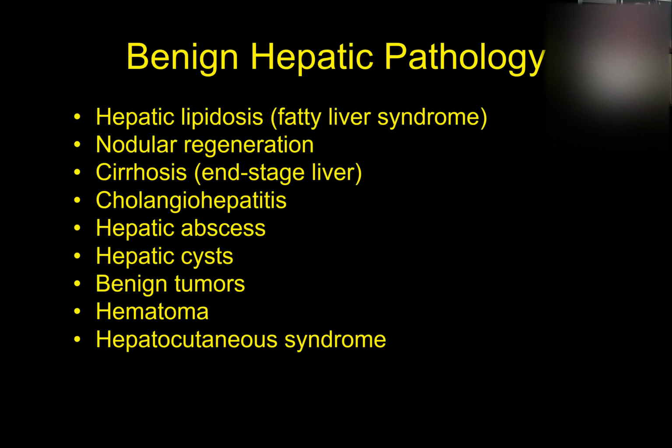All right. So welcome back from your break, and we're going to continue on and talk about certain disease conditions that you will commonly see with ultrasound that affect the liver.